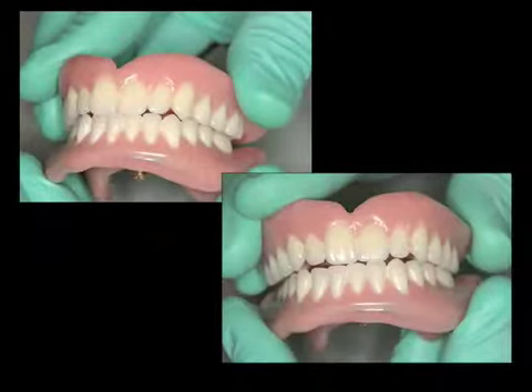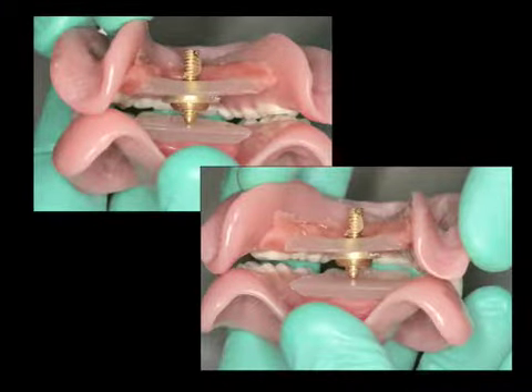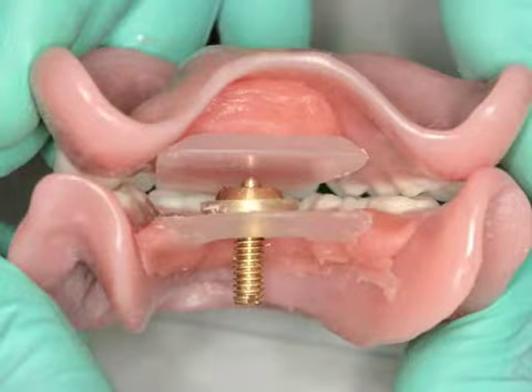It is extremely important that these be placed so that the denture can completely come into contact. As we hold the denture together, the dentist will be able to either open or close the pin, thereby assisting in equilibration or fine-tuning of the occlusal surfaces after the denture has been delivered. This view shows that the pin should be able to be shortened until all teeth contact.